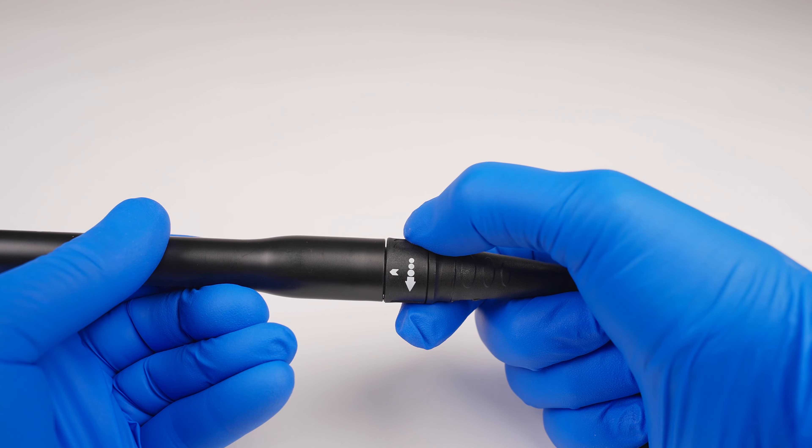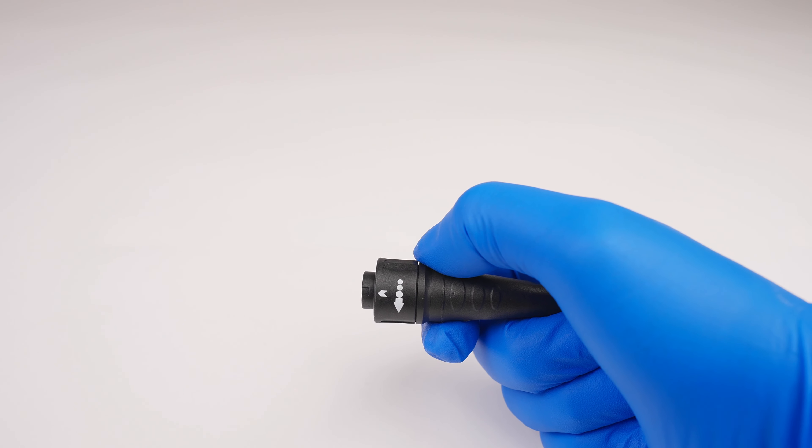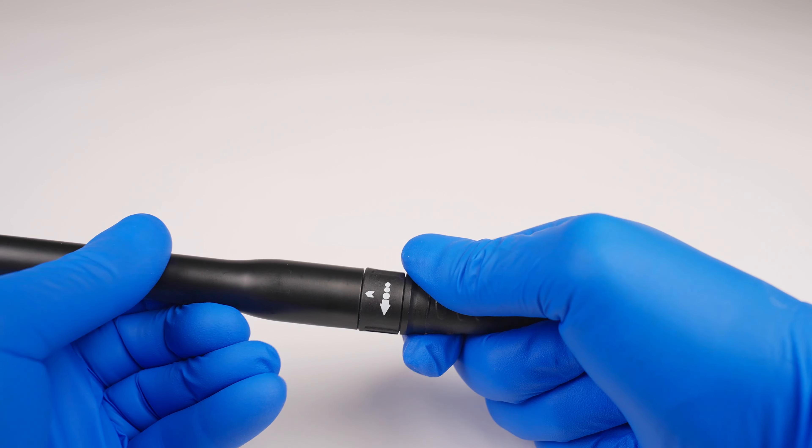The TurboSensor Plus features a new detachable autoclavable 30k handpiece for enhanced reprocessing cleanliness and disinfection.